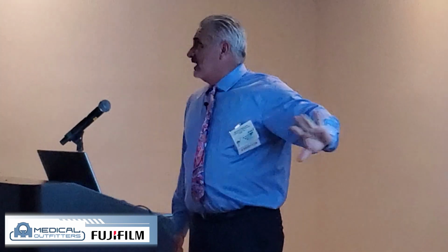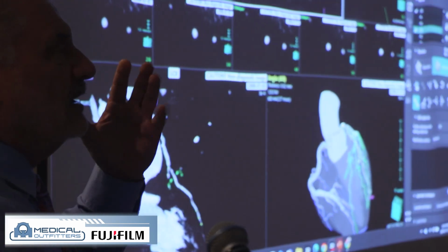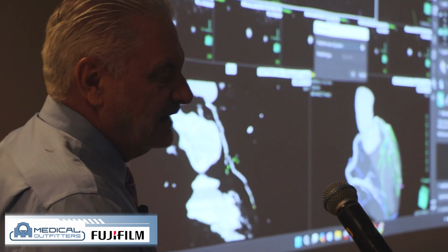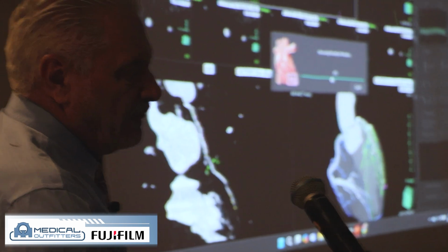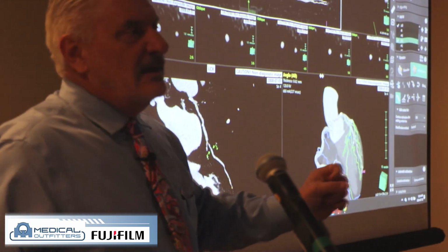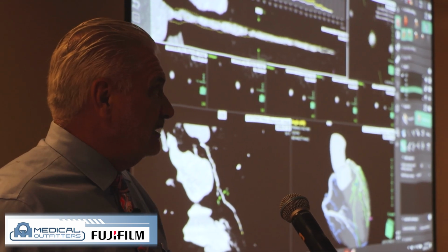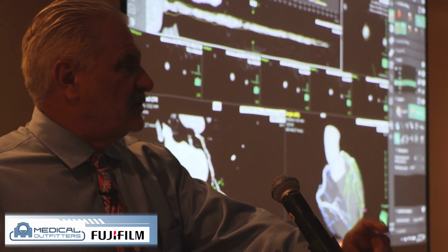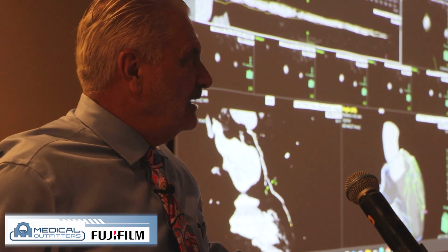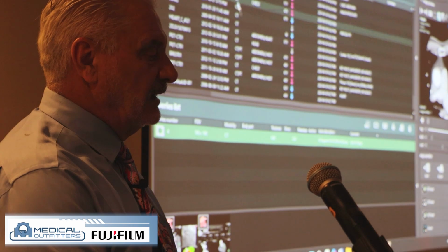So the other thing that we do is when we're all finished with these studies, we go in and we save them. All the companies do it, but I like the way this one does it because if we go in and we save this image, it saves it as a bookmark, sends it to PACS. So when you're reading this on PACS, the radiologist might not read this study while they're sitting in the room with the patient, but you can capture your steps or your bookmarks and send them back to PACS or to the workstation that you use, wherever it may be, and then open it up and it will open up exactly to where you left off when you were evaluating it.